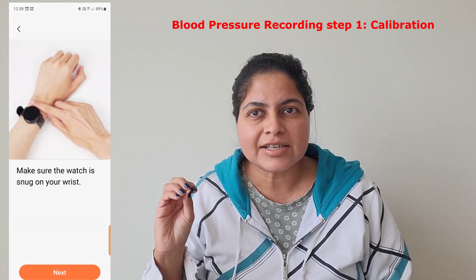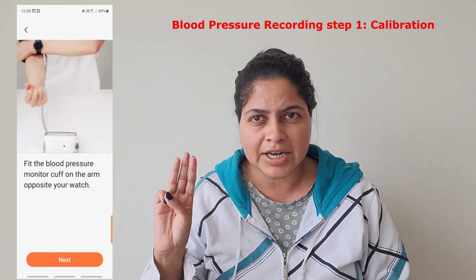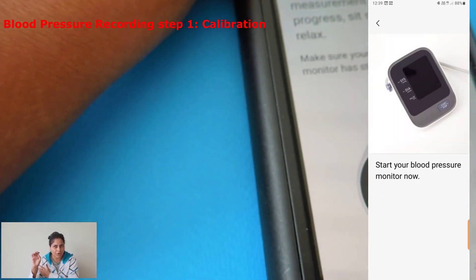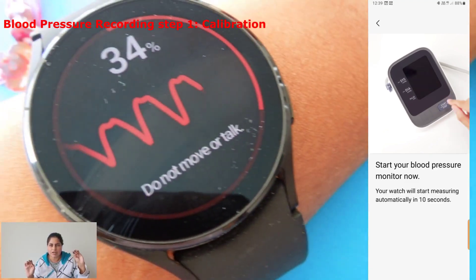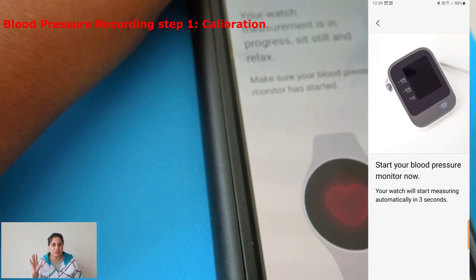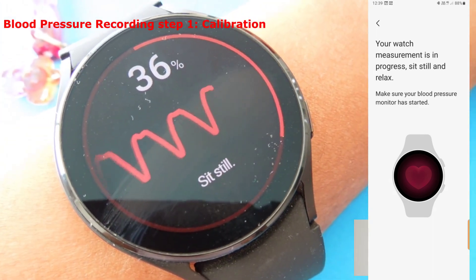For blood pressure, you initially have to calibrate the watch. You use your blood pressure cuff to take three readings with the watch on your wrist simultaneously, so both devices are measuring at the same time. Whatever reading you get from your blood pressure monitor, you enter into the Samsung Health Monitor app — three times. Once done, the watch confirms it's been calibrated. This calibration lasts for 28 days.